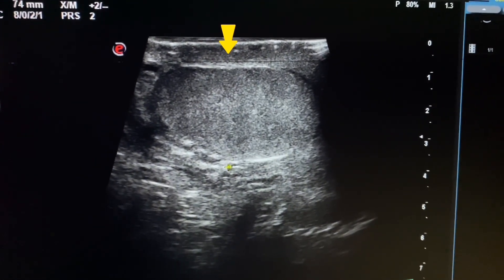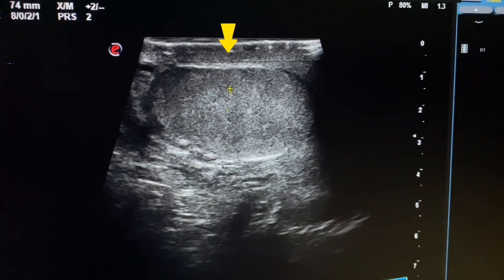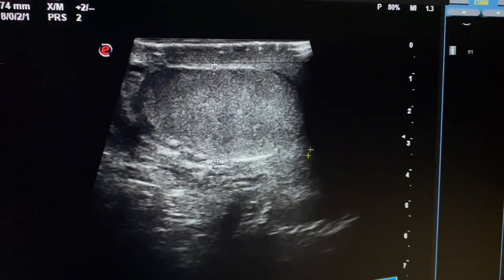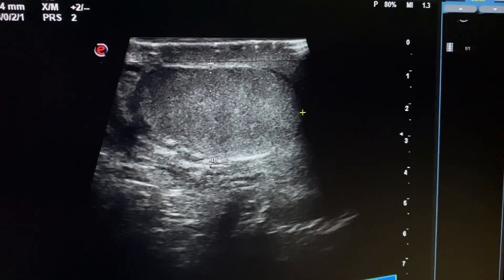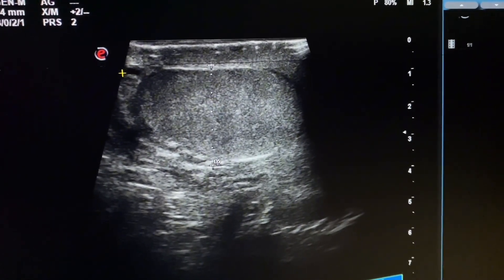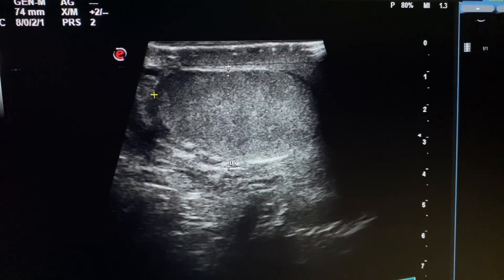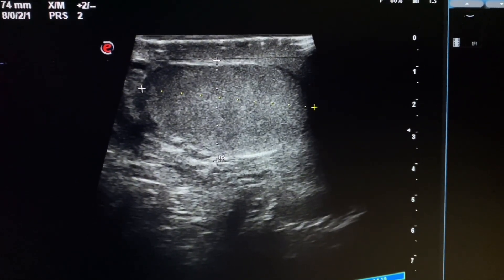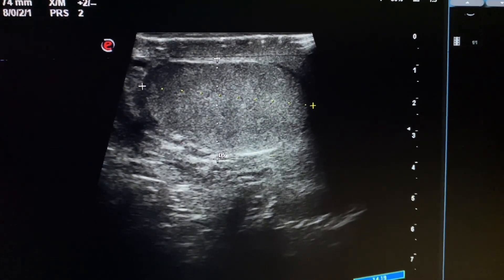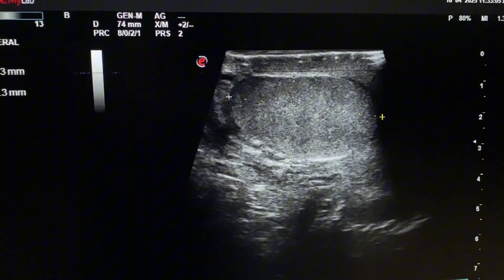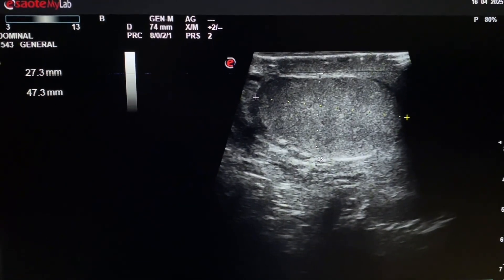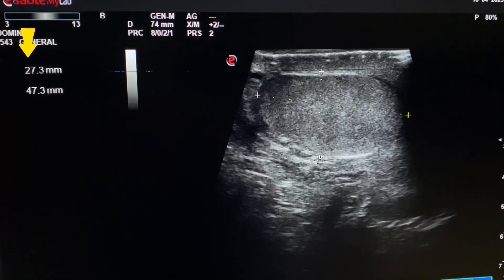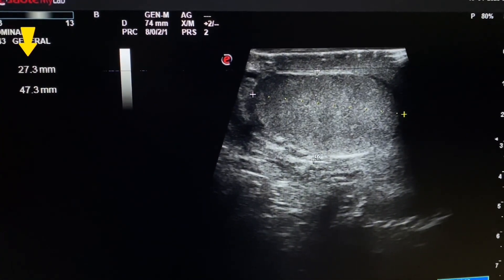We will measure the size of the left testis. The size of the left testis is 27 x 47 mm.